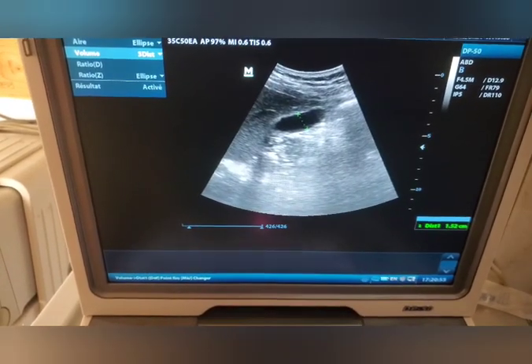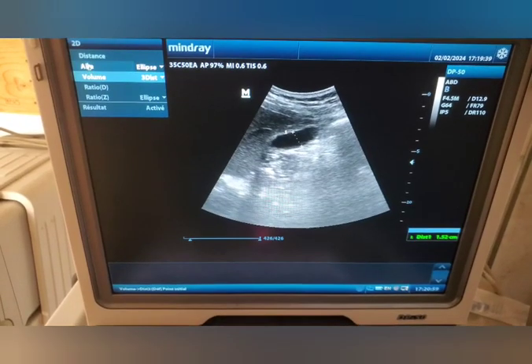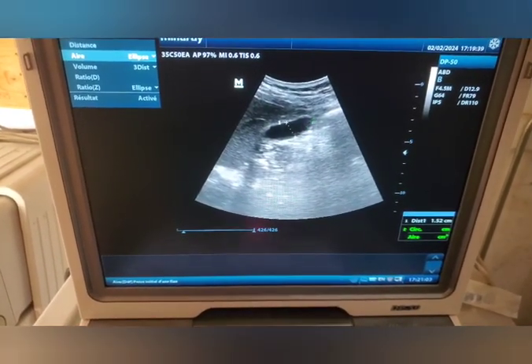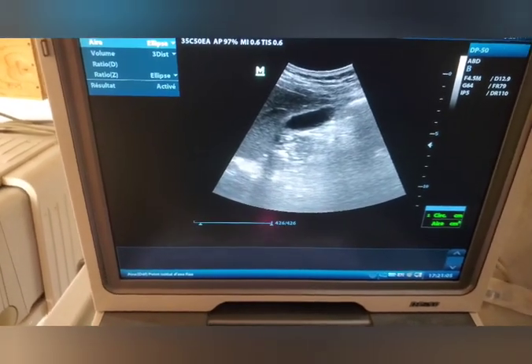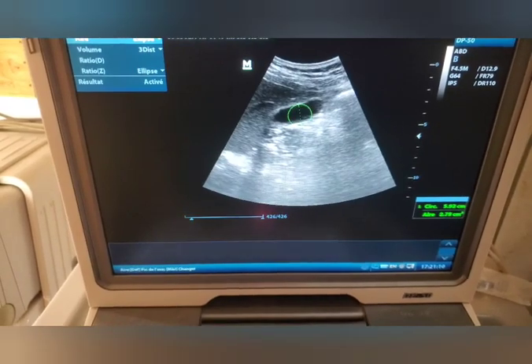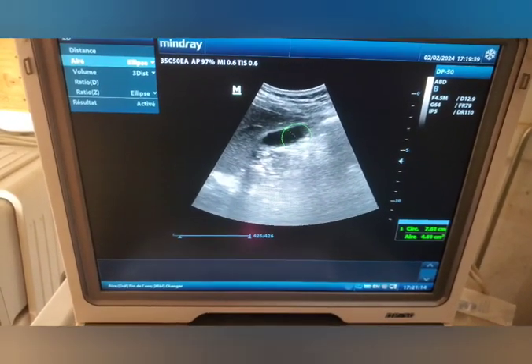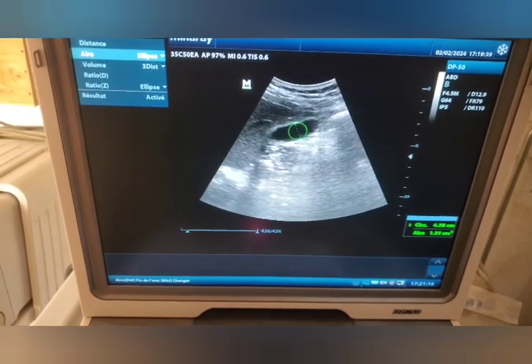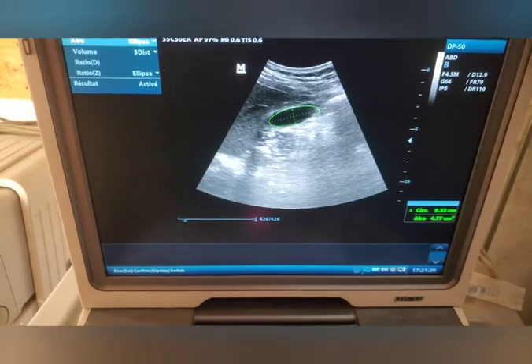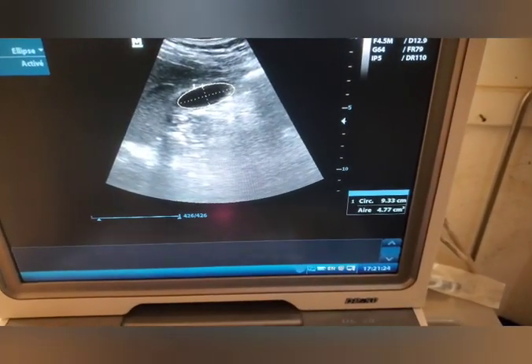Now, for three-dimensional, you can decide to take this one. This is one diameter. And then, in this case, I'm not going to measure the volume, but inside the area. Is it clear? So I'll take the diameter. Let's go back. I'll take this first, and then I say it is an ellipse. See, that is an ellipse as such. So it gives me the area of 4.7.